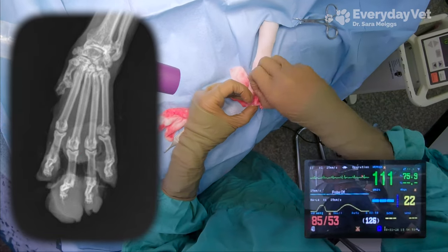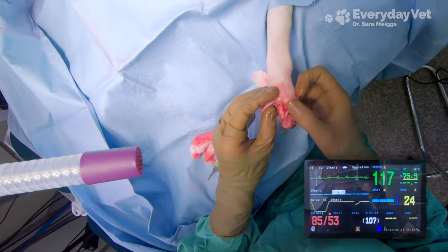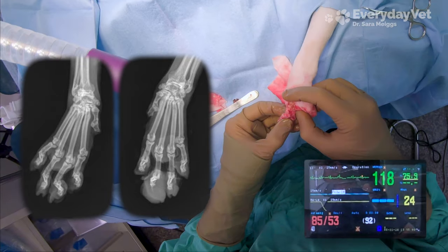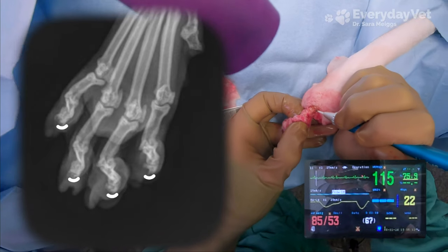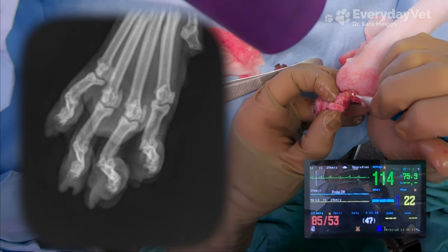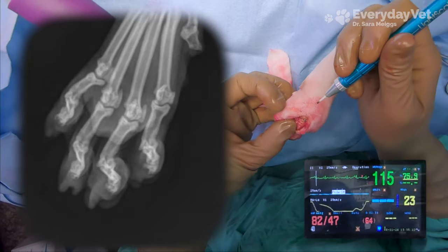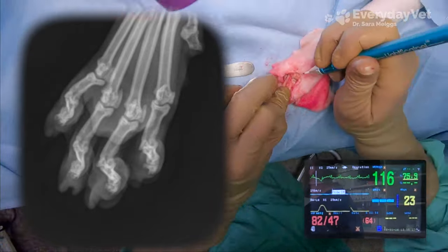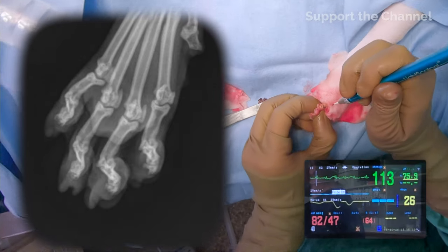You really want to avoid angling towards the wrist and the palm of the foot because you don't want to accidentally char the bone that's going to be remaining behind. I also want to point something out on his x-ray: he was declawed when he was younger. Usually when a cat is declawed, the distal phalanx is amputated and completely removed, but in his case he still has a distal phalanx — it's just shorter than usual. His declaw was done incompletely and some of that distal phalanx was left behind, so he has some areas where a partial deformed nail has developed.